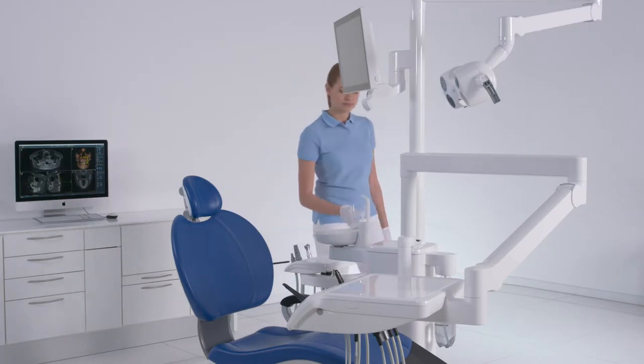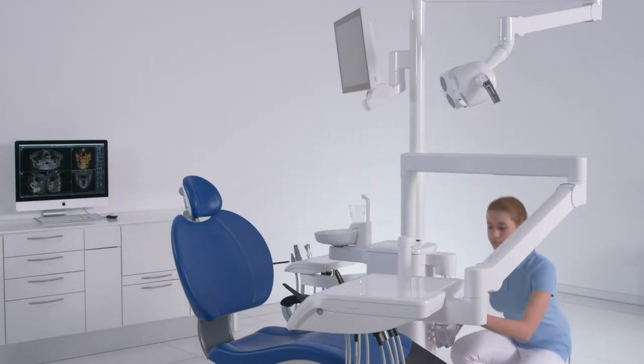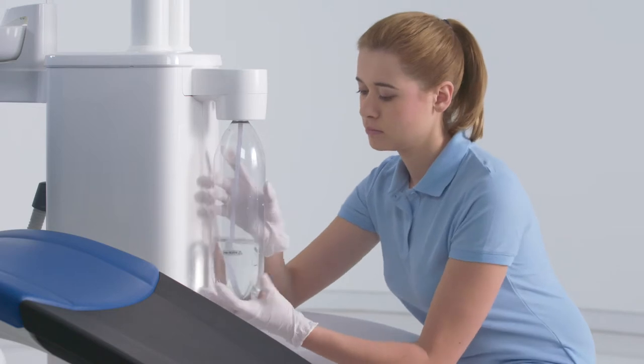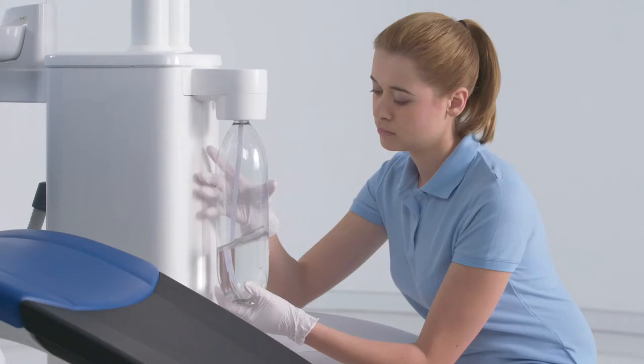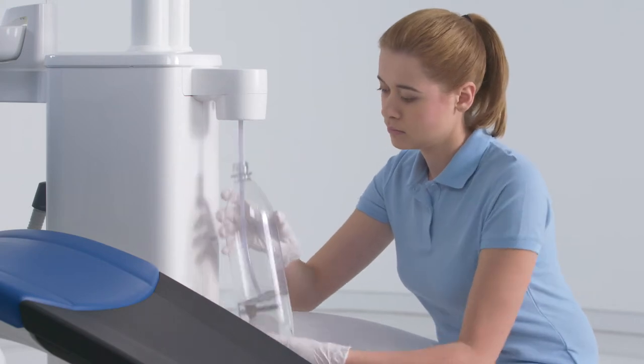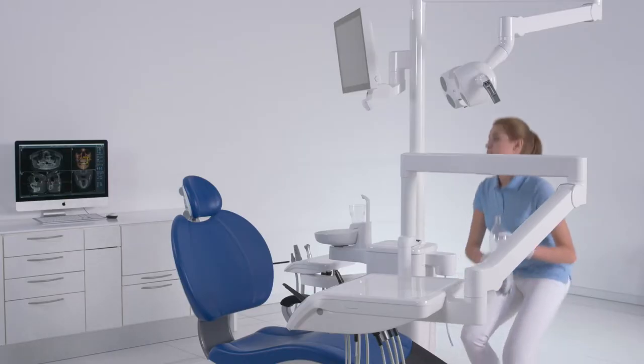Sanitize your treatment center at least every four weeks or after an extended period of non-use. Sanitation will help deter possible deposits on the walls of the water lines and effectively prevents the formation of a biofilm.